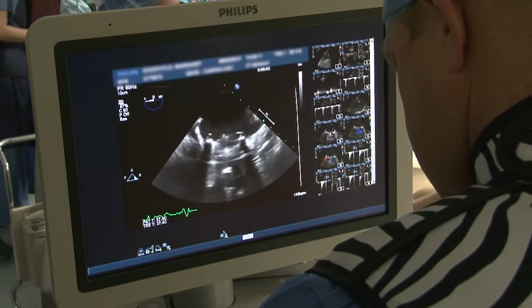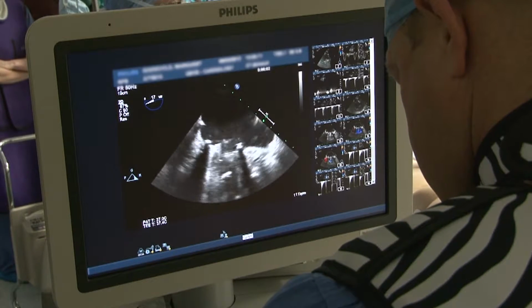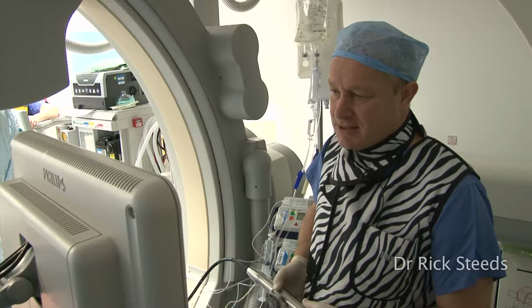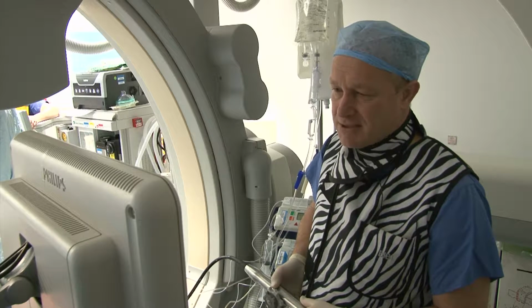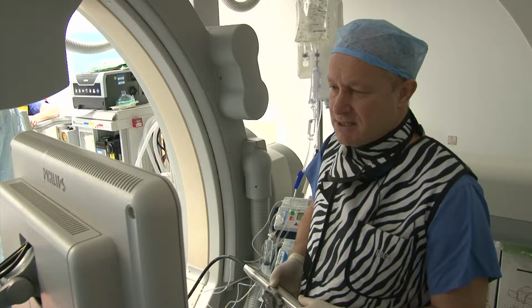So our routine is to do both a transthoracic and transesophageal study before people have general anaesthetic, so that you get stable haemodynamic conditions. It's useful because there's usually a delay between the pre-implantation TOE and the day of implantation, and sometimes our operators are different.